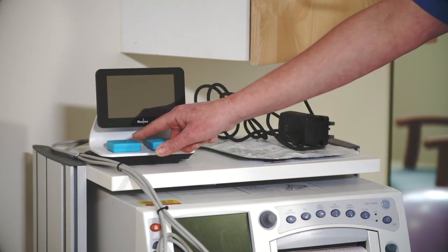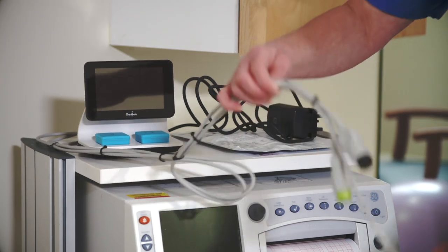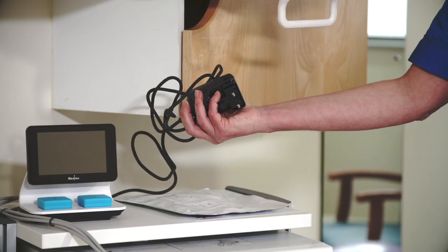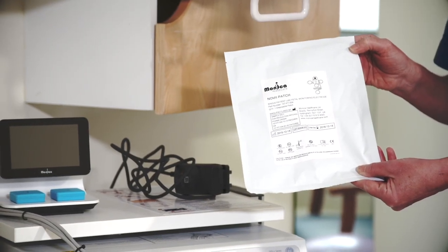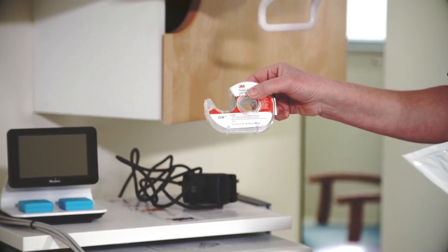Before you start, confirm that there are two pods, one in each of the two Novi charging bays, three fetal monitor cables and a power supply cord. All four should be connected to Novi. You should also bring with you a patch in the silver foil pouch and a roll of skin prep tape if these items are not available in the L&D room.